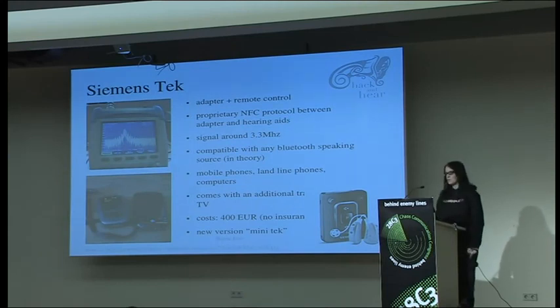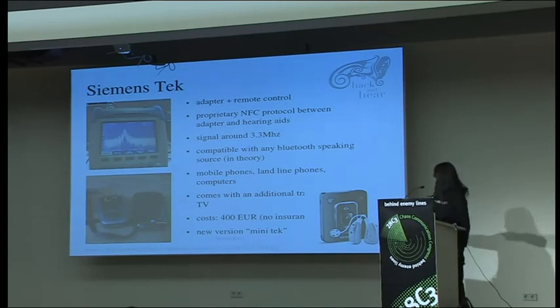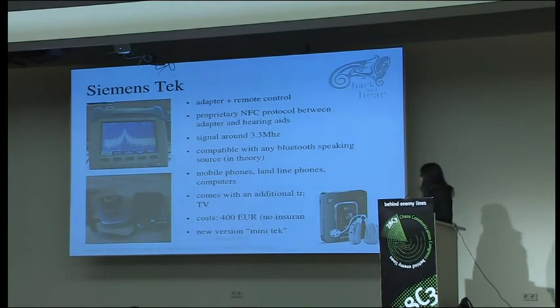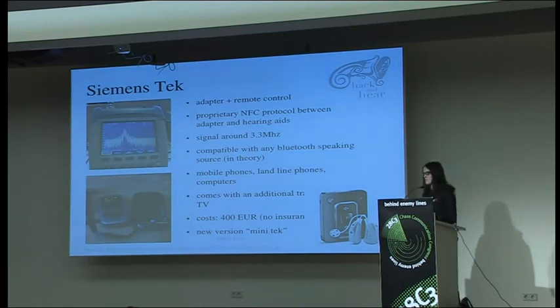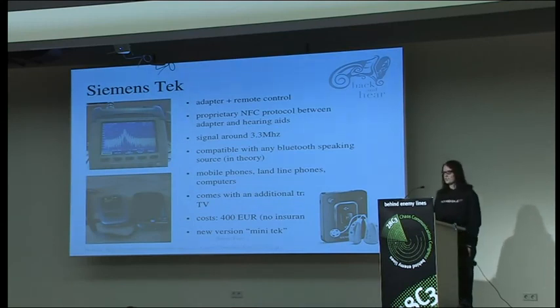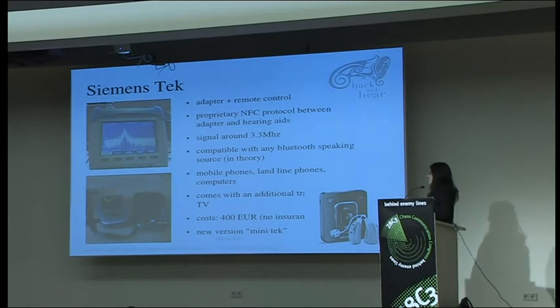They also released a new version of it. This is on the right side here. It's called MiniTek, and it actually has fewer features than the old one because they removed the display. And they still want 400 euros for that, and you don't get a discount if you bought the old one.